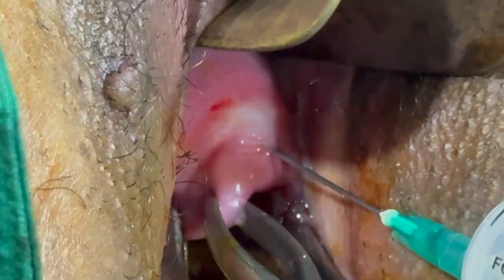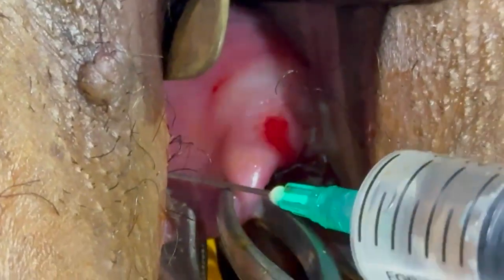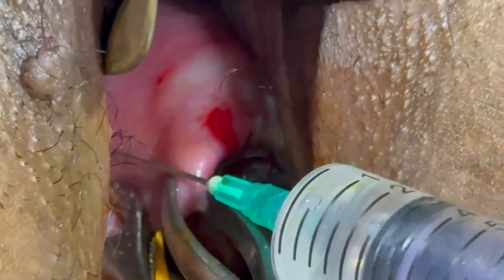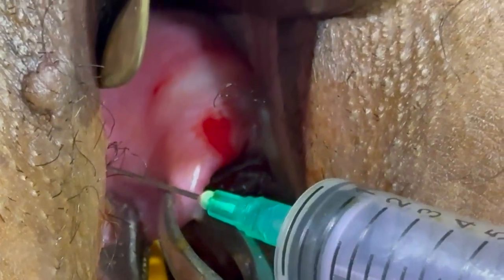So how do we decide whether to give McDonald's encerclage or Shirodkar's encerclage? It is mainly based on the length of the cervix. So now you can see that we are preparing the incision site.